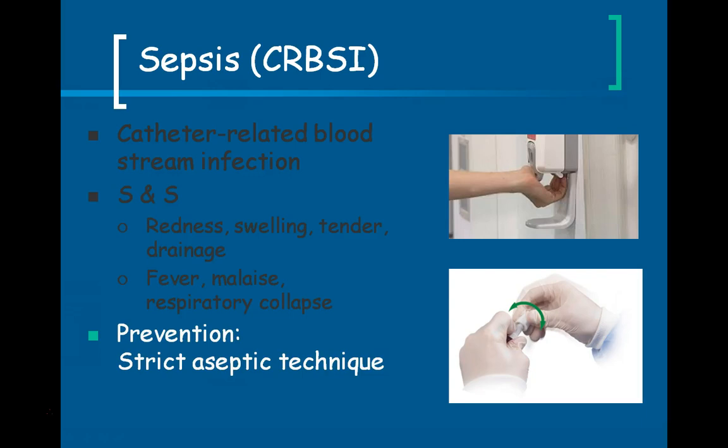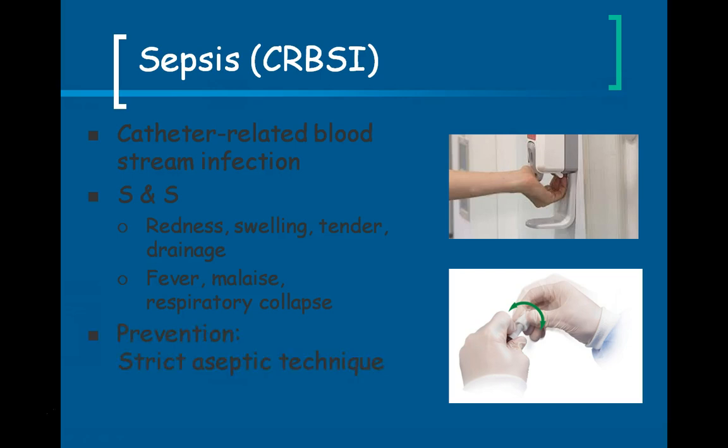Okay, so here's, again, just some pictures showing the nurse using hand gel and really scrubbing the hub, scrubbing the threads of the hub and the top of the hub, and really good aseptic technique.